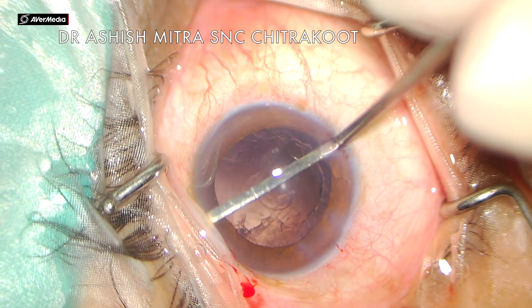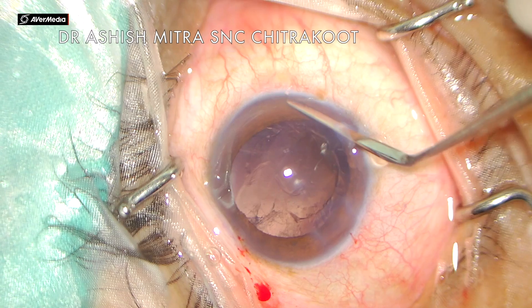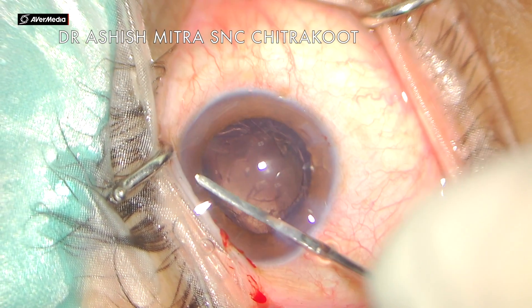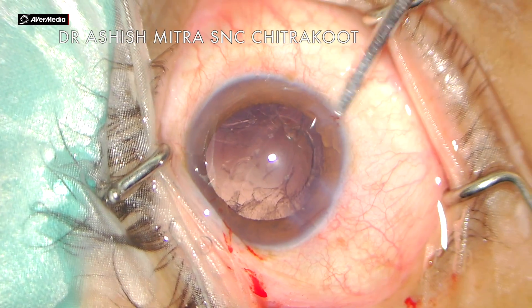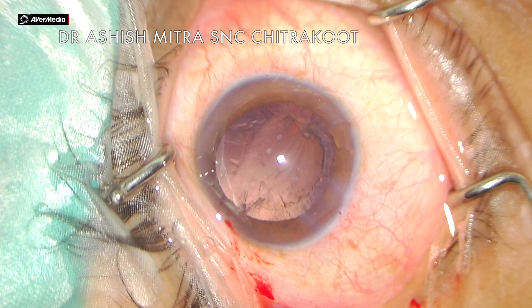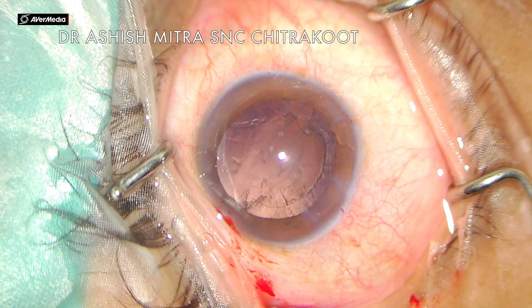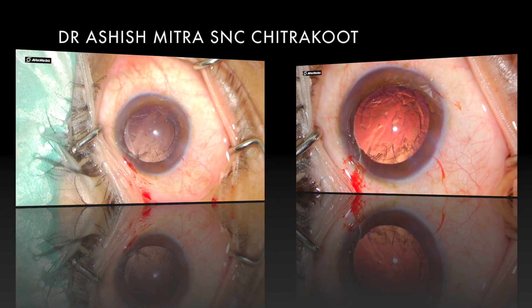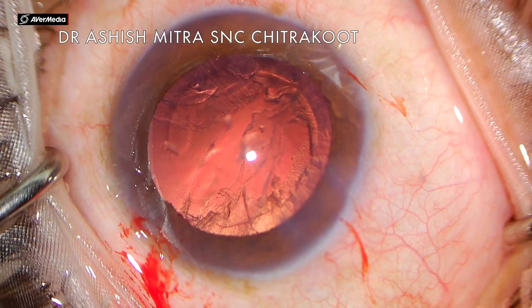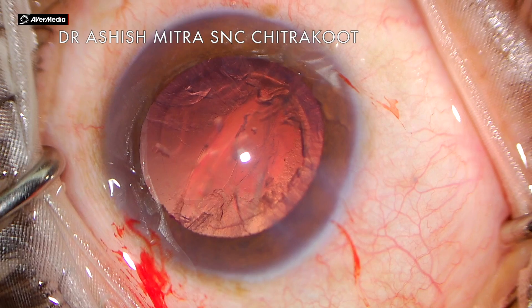I'm sweeping the iris repository and there is some amount of vitreous tags; however, it is not disturbed too much, so initially it's not a problem. We'll be discussing the management of PCR — how I did what I did, what things have to be taken care of, and what my settings were in this case.